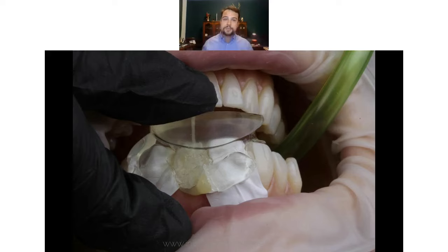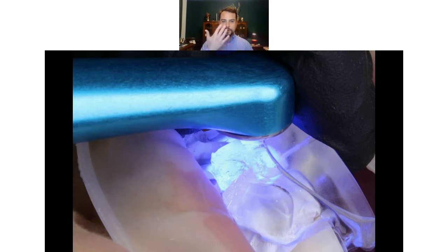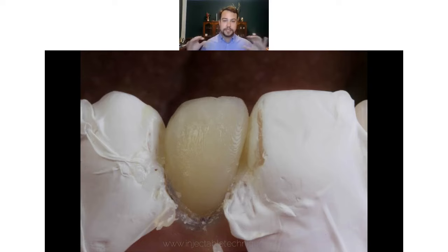As you can see, I'm cutting my transparent silicone following the gingival margin, so it's easier for me to remove this excess while it is in this light-polymerized state after a few seconds of polymerization. Then we go for the full polymerization. I double the time from the vestibular and incisal, and palatal if needed, if we're doing palatal veneers as well. And this is after removal of the transparent silicone.